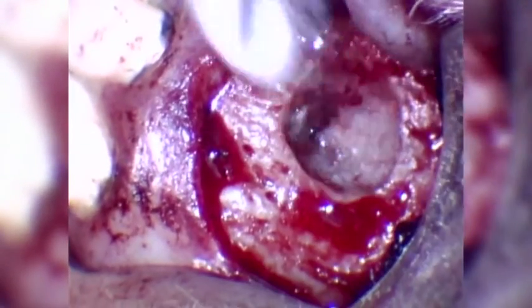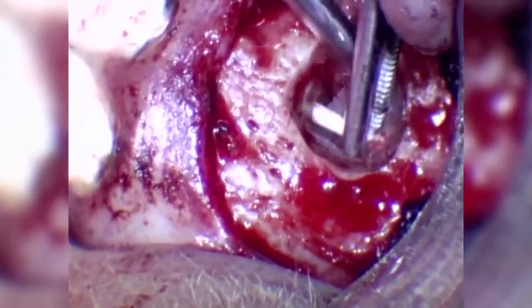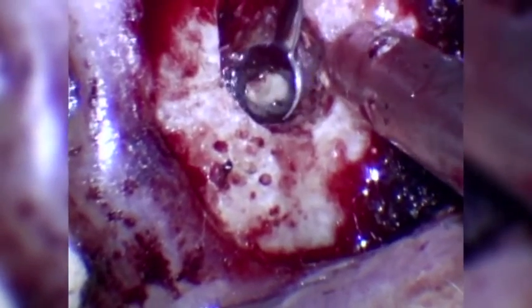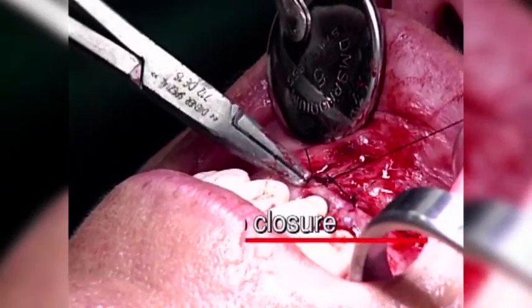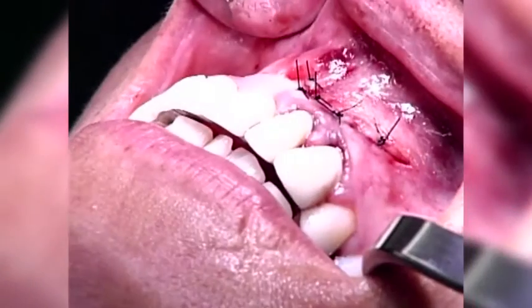After achieving hemostasis and a dry apical field, the retrograde cavity is dried with air or paper points. Observation of the retrograde preparation with a micromirror. The root canal is filled with a suitable material, which is independent of the preparation technique. Finally, the mucoperiosteal flap is closed and compressed for one minute. The surgical wound is then closed with suture to allow healing by primary intention.